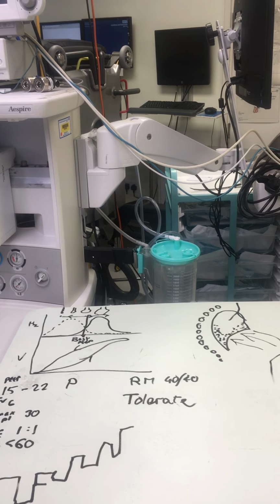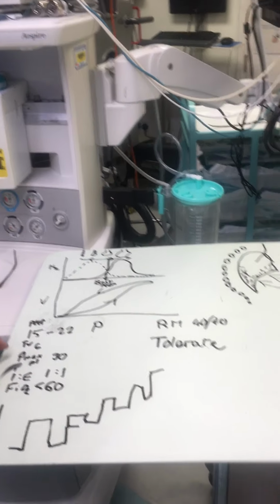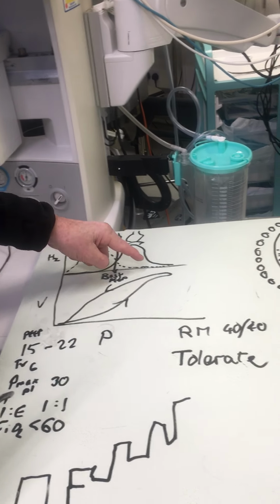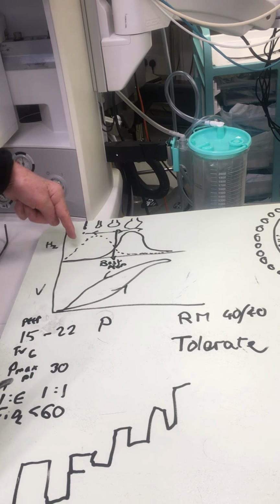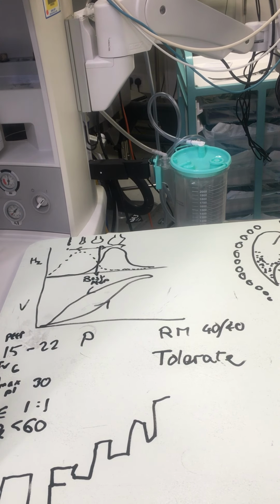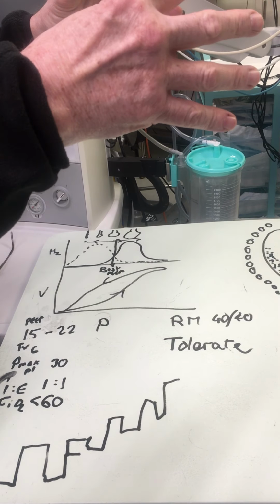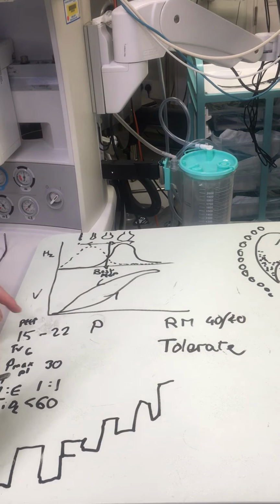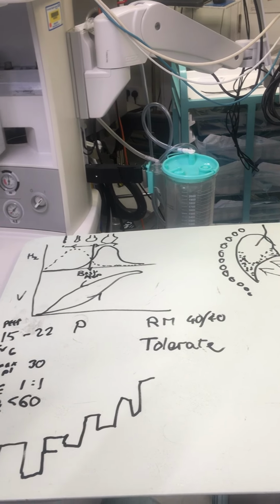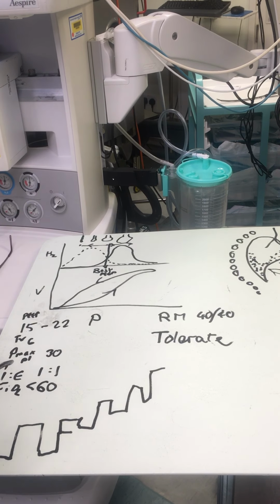What were you doing with the PMAX when you were coming down on the PEEP index? Leave it the same, because you're just looking at that tidal volume of 6. The Pmax is always above the PEEP. So the Pmax is not holding, it's doing the ventilation, but it's not holding the lung open. The recruitment manoeuvre is all about getting the lung open, and then you start fiddling with the Pmax in order to get your tidal volume and your CO2 clearance. So you may use a small driving pressure above a high PEEP, which you then have to turn up a bit in order to get the tidal volume that you were looking for.